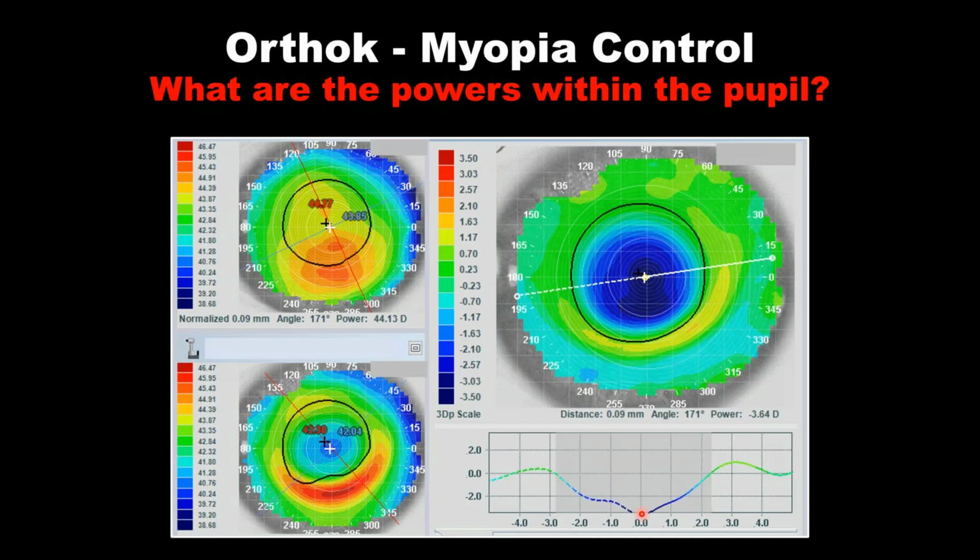Now, is this a good myopia controlling outcome? You might ask yourself, yes, I've done a good job of creating a bullseye and centering the hydraulic forces, creating the epithelial shift over the pupil. That's great, but have I introduced enough aberration for this eye for this to be deemed an ideal myopia controlling beginning?